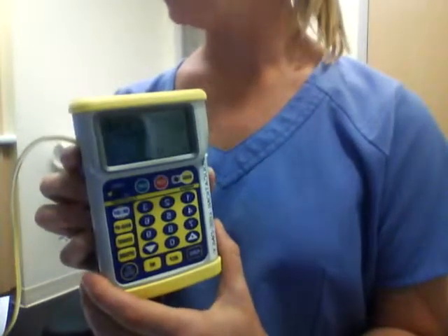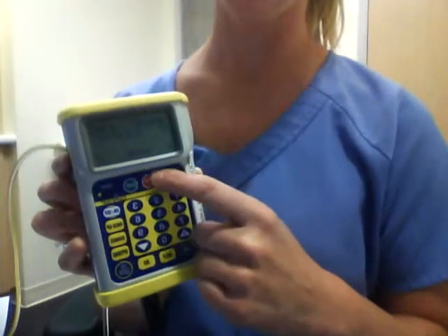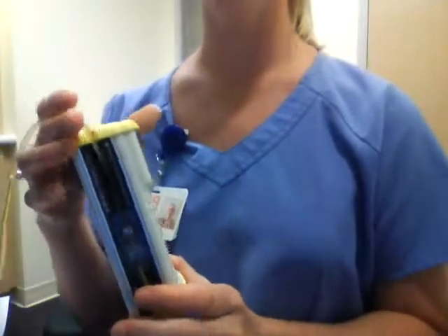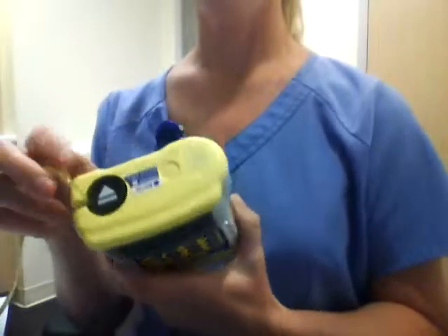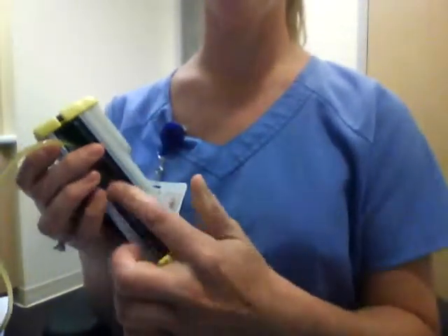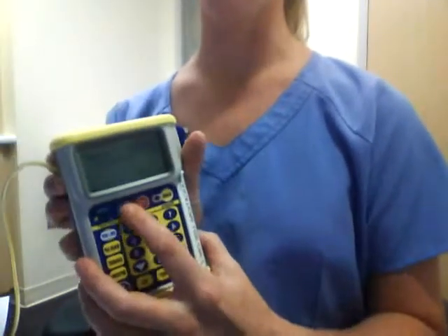When the screen displays check cassette, you'll press the silence key and then the stop key to clear the alarm. You'll want to reinstall the cassette here, which I showed in video one, but a quick summary: press and hold this, pop out the old cassette, reinstall the cassette, and then press start.